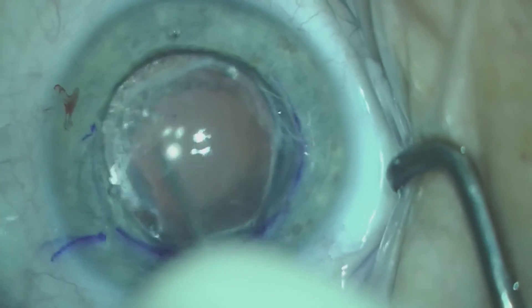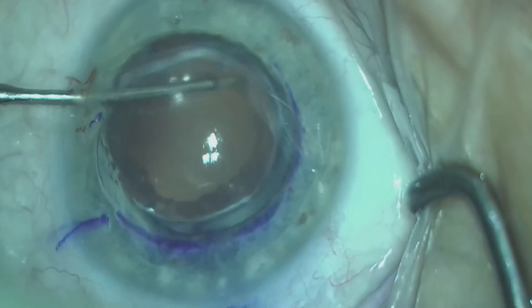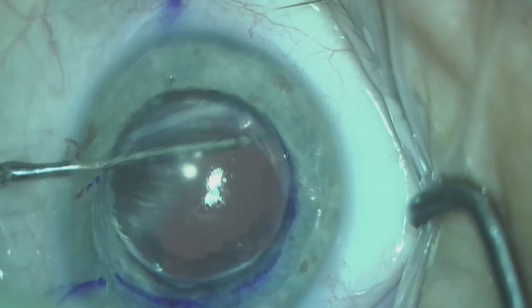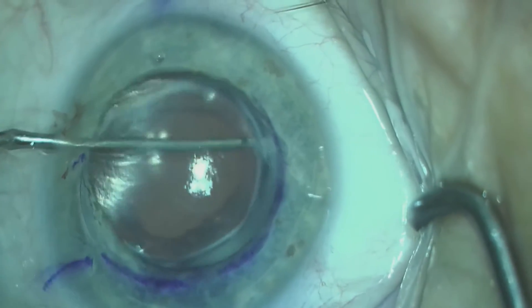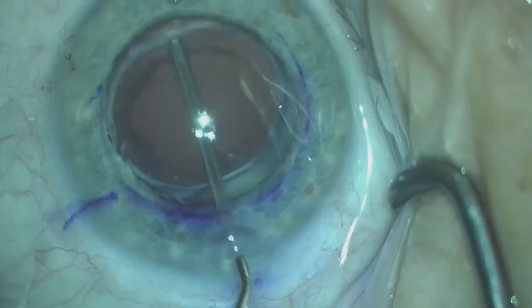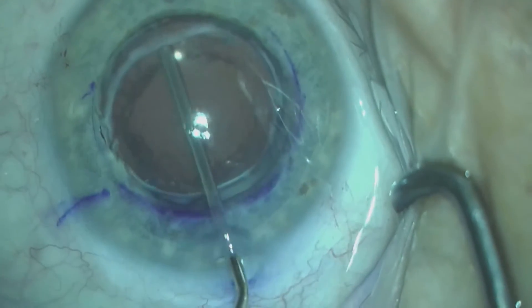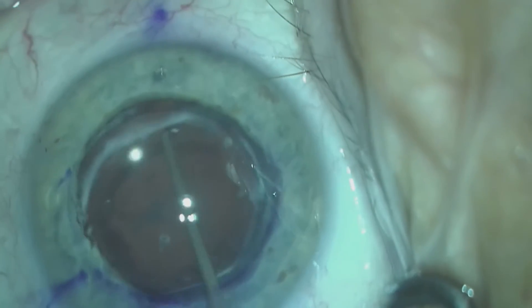A Donnenfeld LASIK flap elevator is then used to free the anterior capsule from the lens. In this process, you will see that the bag-lens complex does have significant zonular laxity. You can see the capsule move freely due to the loose zonules. A viscoelastic is then attempted to be injected under the anterior capsule and around the lens; however, this was unsuccessful.